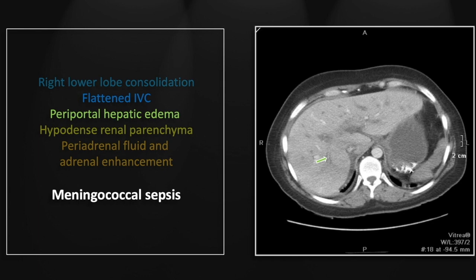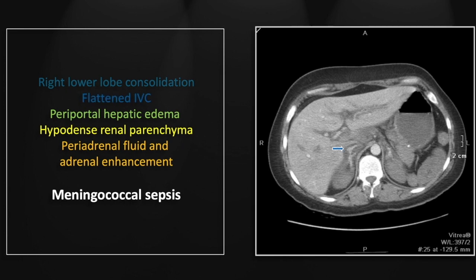In addition, probably related to underperfusion but possibly also related to some degree of hepatitis, there is periportal hepatic edema. Lower still, we again see the flattened IVC. There is periportal edema in the liver and marked underperfusion of the kidneys, which are showing essentially no contrast enhancement at all.